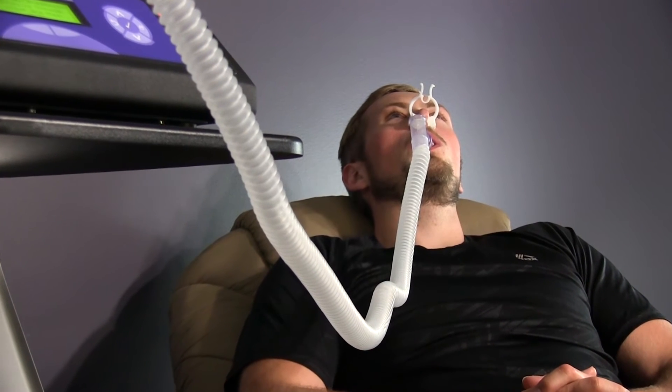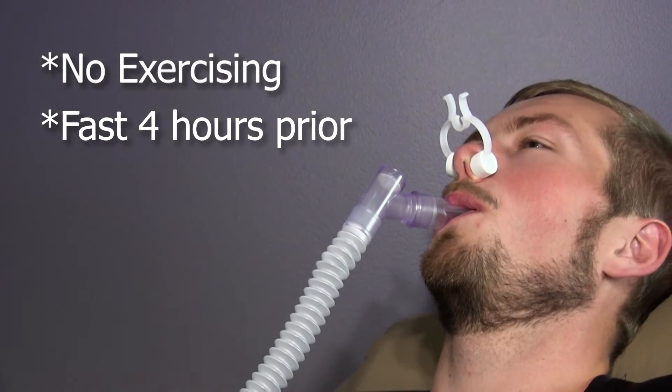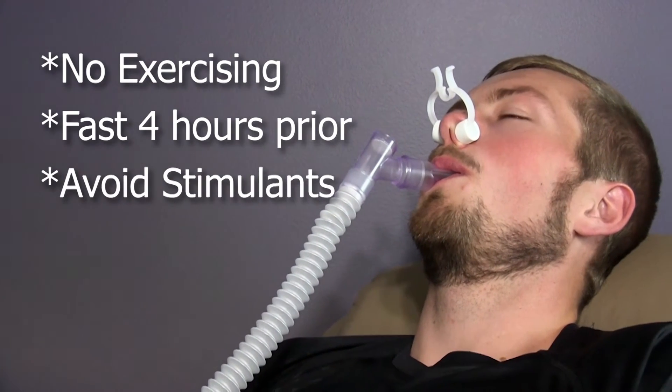Test results will be most accurate if the client comes prepared by not exercising the day of the testing, fasting four hours prior to testing, and avoiding stimulants.